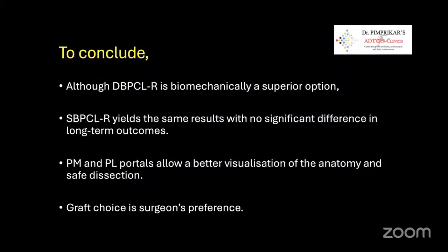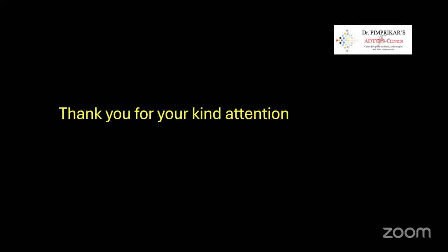So to conclude, although double bundle PCL is a biomechanically superior option, single bundle also yields the same results with no significant difference as far as long-term outcomes are concerned. PM and PL portals allow better visualization of the anatomy and safe dissection. Graft choice is basically a surgeon's preference. One could use a soft tissue graft or a bony graft. I thank you for your attention.